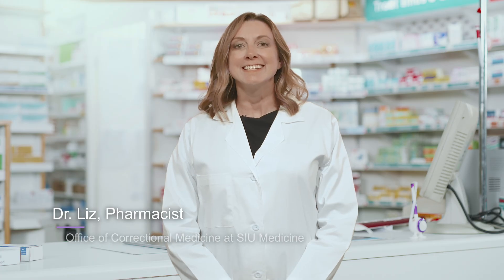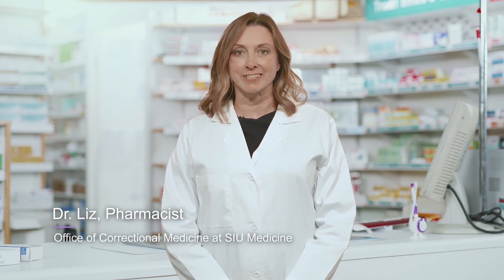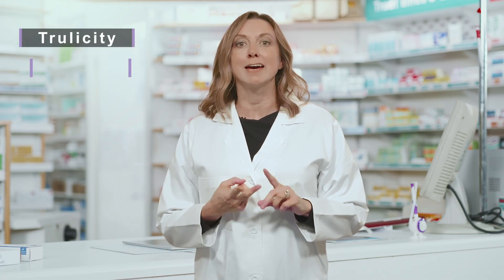Hi, I'm Liz. Today I will show you the proper technique for using a GLP-1 injector. Newer medications to help treat diabetes, the ones that work with your body to help it release its own insulin, come in a pen with a preset dose and the needle already attached. Some examples of these types of pens are Trulicity and Mounjaro.